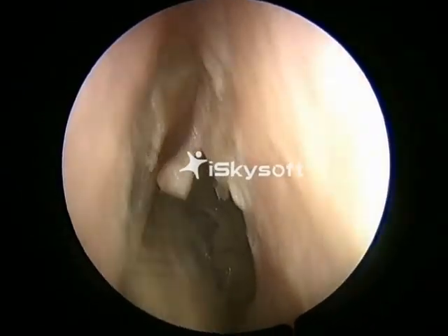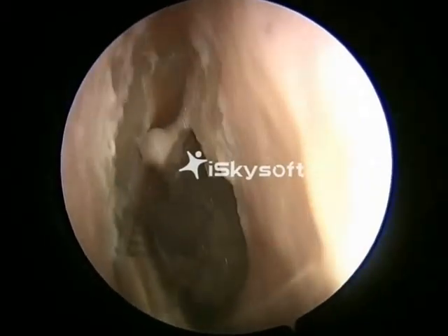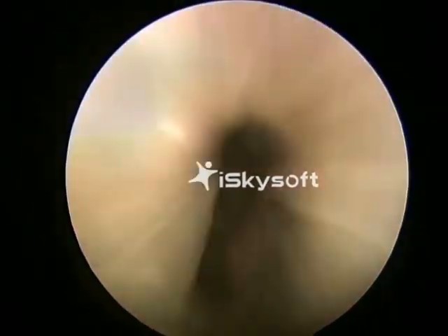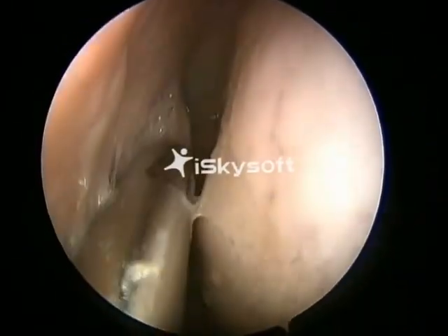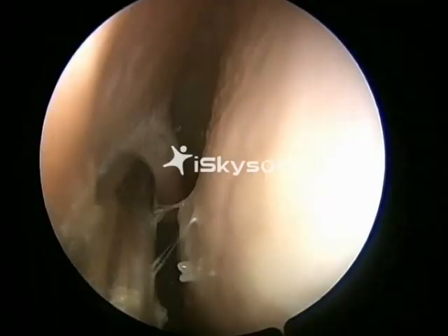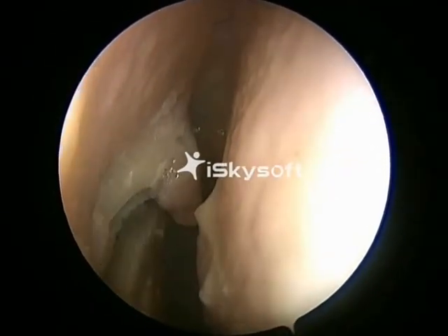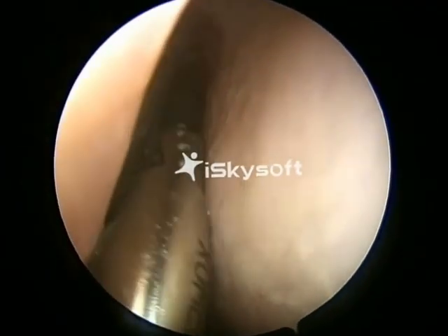The mucosa of the septum is removed to a length and a height of 2 by 3 centimeters. We are debriding the mucosa anterior to the middle turbinate on the right side and over the nasal septum.